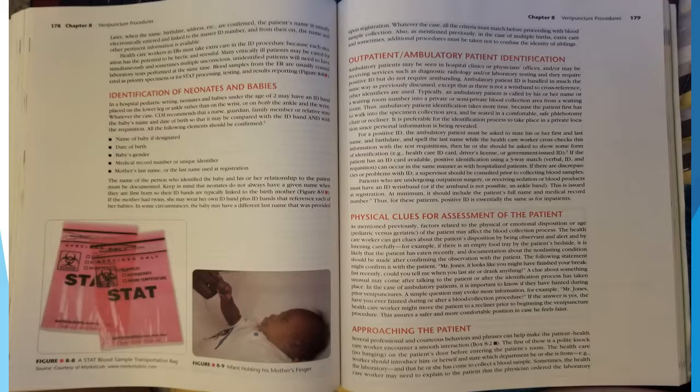Then he or she should be asked to show some form of identification, such as a healthcare ID card, driver's license, or government issue ID. If the patient has an ID card available, positive identification using a three-way match, verbal ID, and requisition can occur in the same manner as with hospitalized patients. If there are discrepancies or problems with ID, a supervisor should be consulted prior to collecting blood samples.